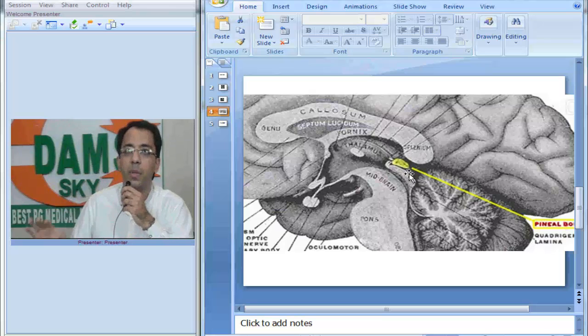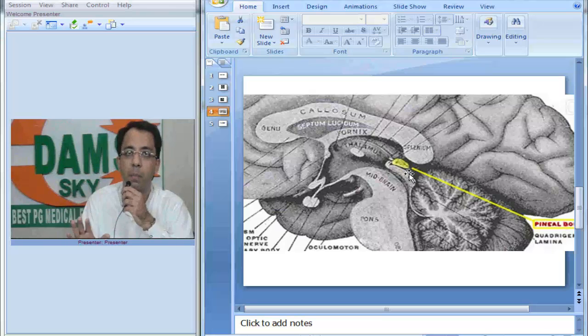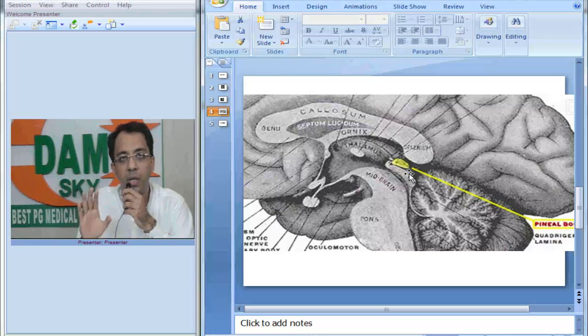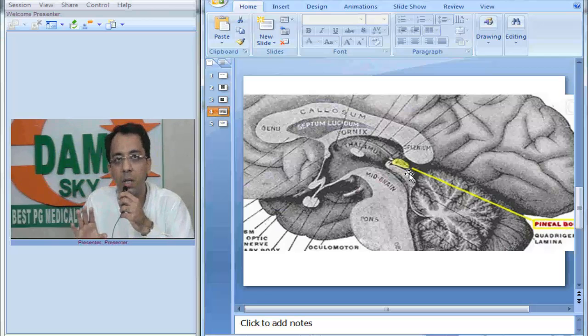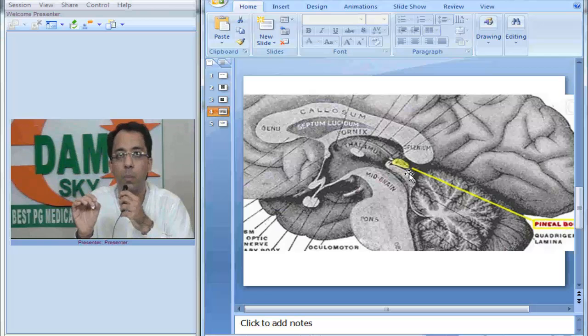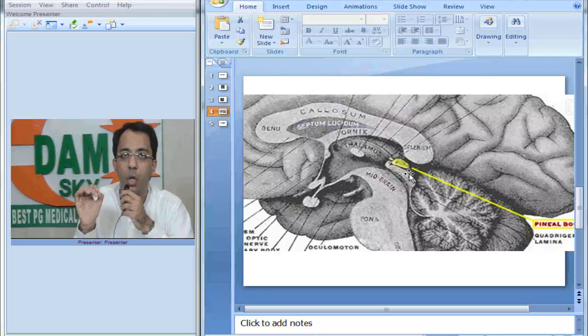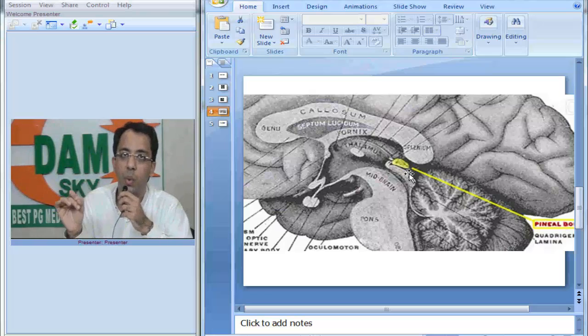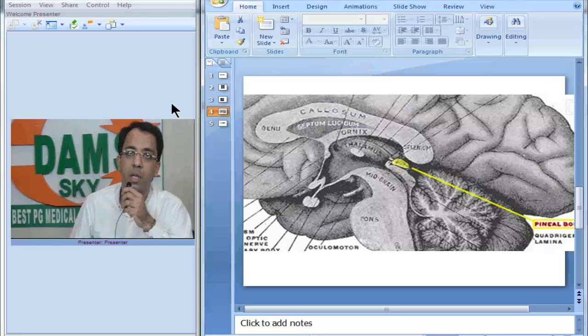Now think of it, it will compress the tectal plate leading to the upward gaze palsy. This has been called a syndrome called Parinaud syndrome. Now do you understand this?